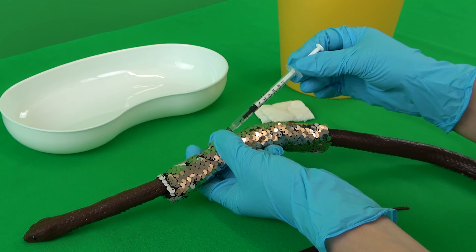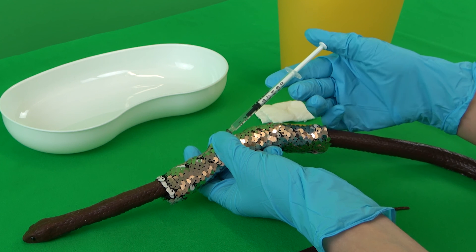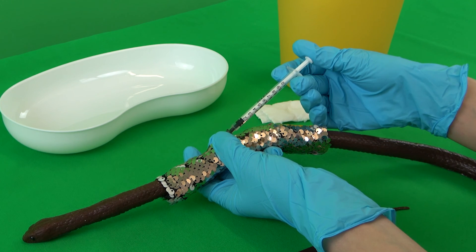The cannula is then fixated on the hub and the syringe is aspirated. If blood can be seen within the hub, a new injection site must be chosen. If air can be aspirated, then the cannula has punctured through the skin. When using a simulator, air is always aspirated. With the cannula in the correct position, the hub is fixated and the injection solution can be applied.